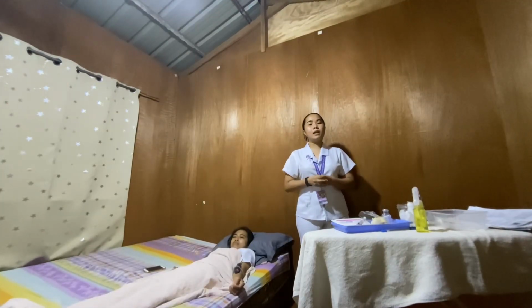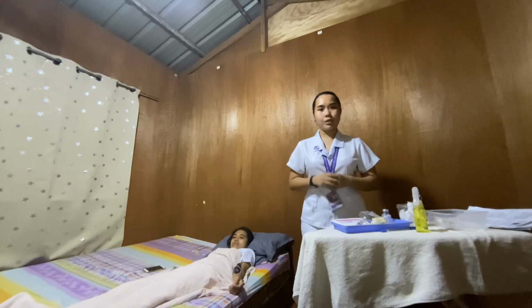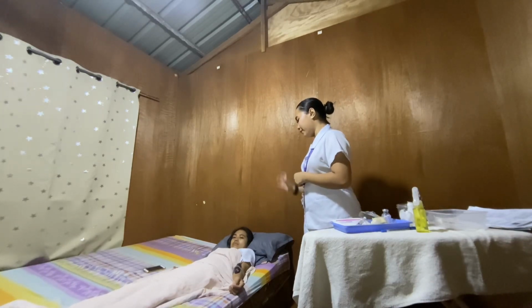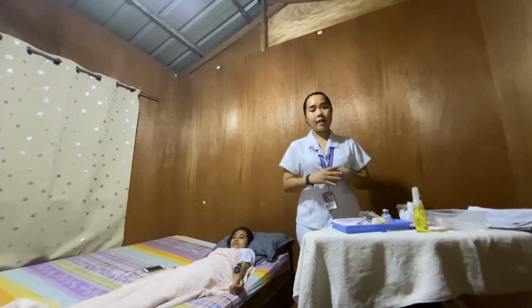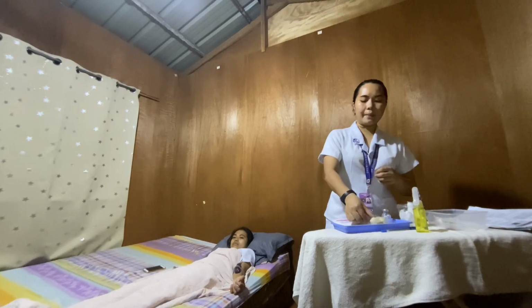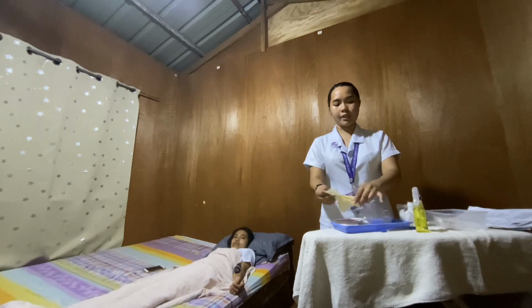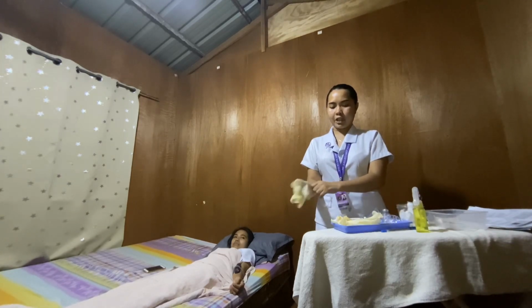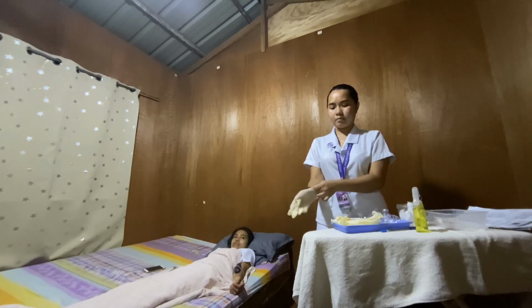Now, we will be going to select a site. It is important to remember that we should avoid the sites that are tender, inflamed, swollen, or those that have lesions. Next is to apply gloves, and this is to protect ourselves and, of course, the client from any spread of pathogenic microorganisms.